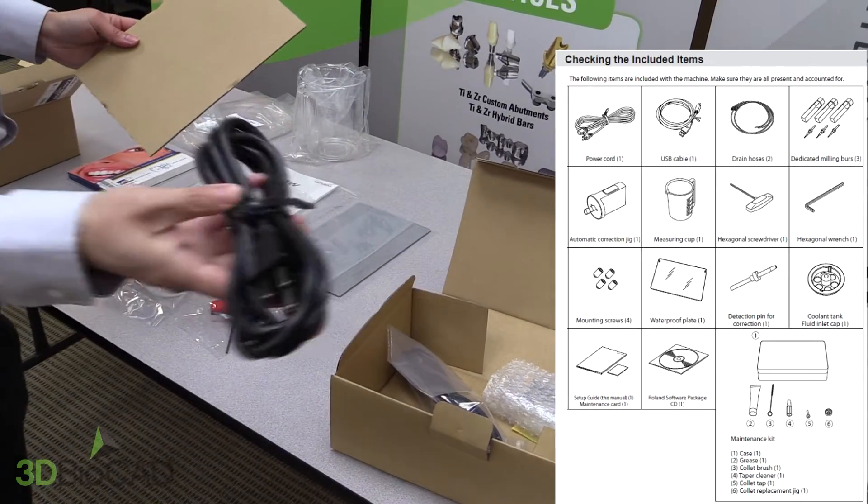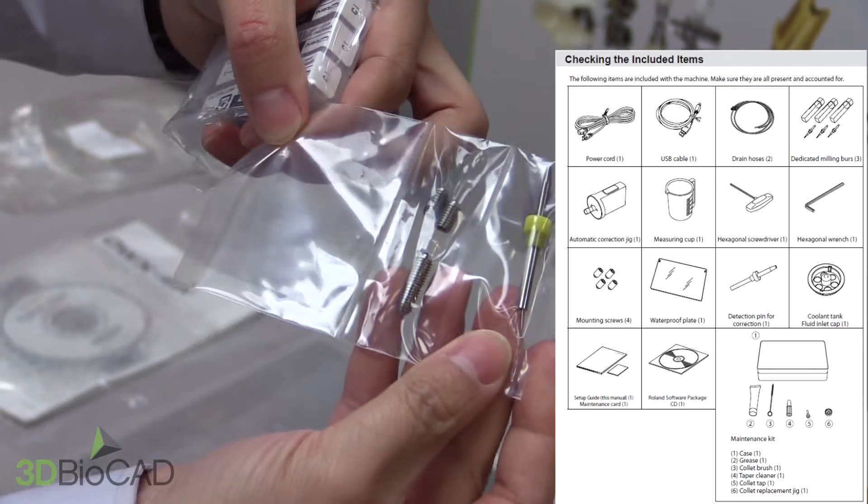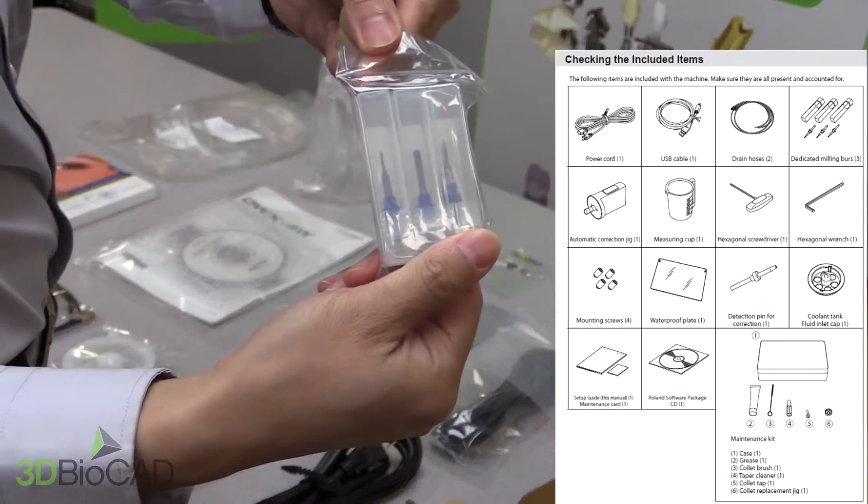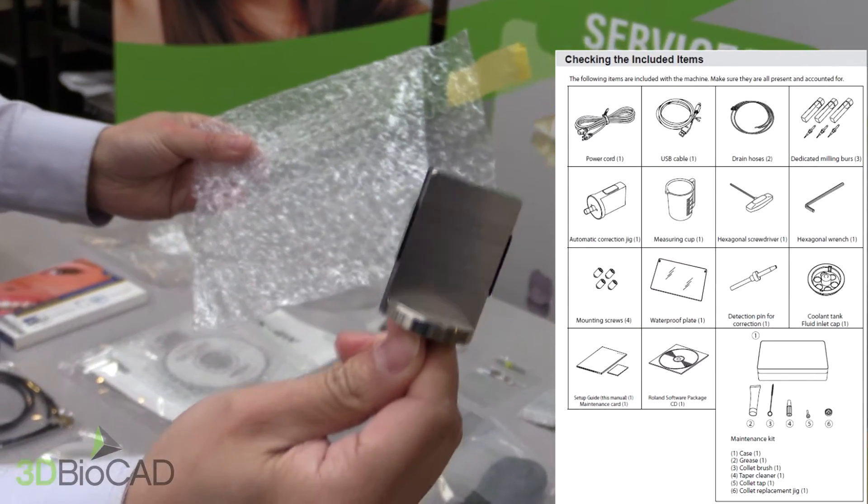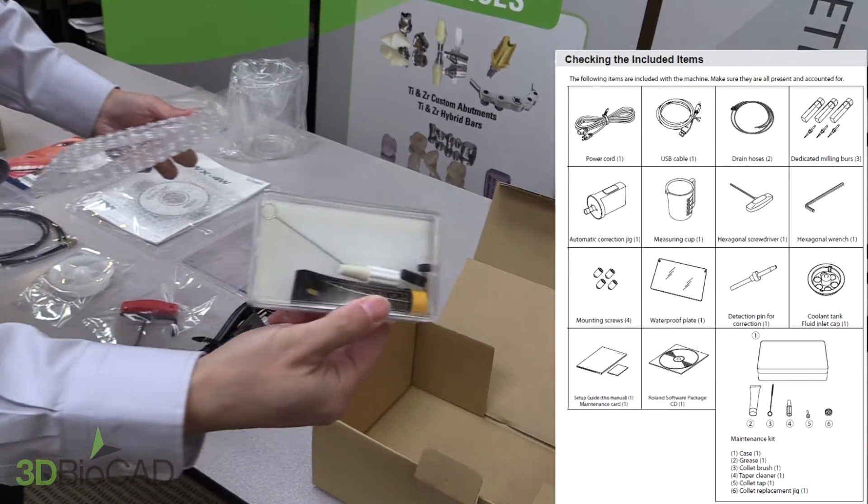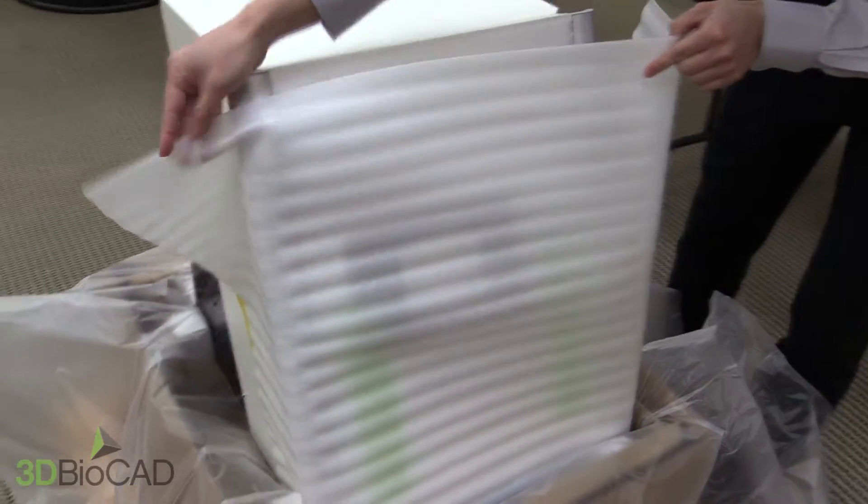You'll see the power cord and USB cables, four mounting screws. There will be three milling burrs. You'll see an automatic correction jig and the maintenance kit. After you ensure all components are included, you can unwrap your machine.